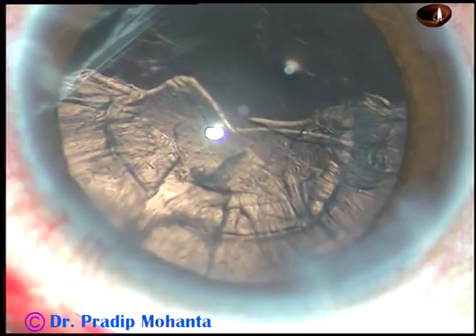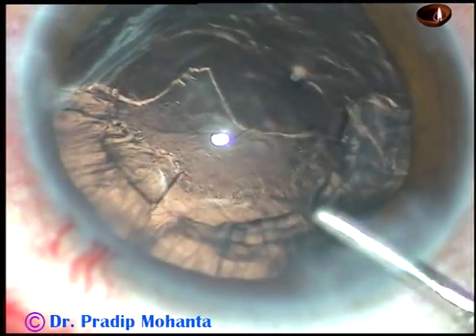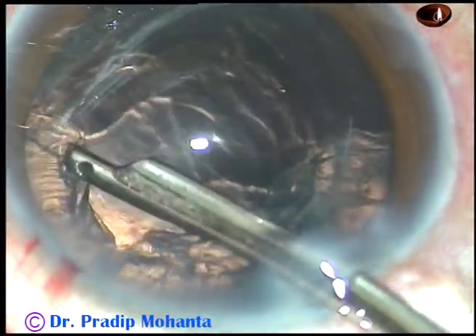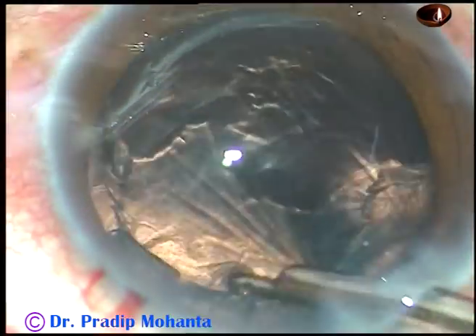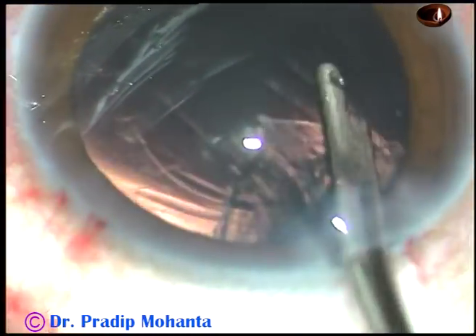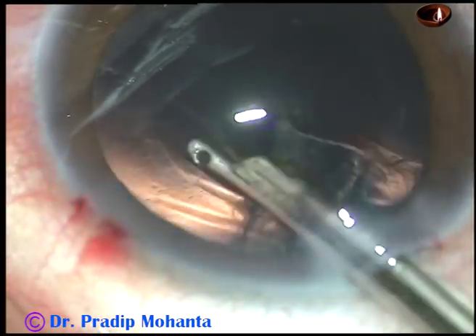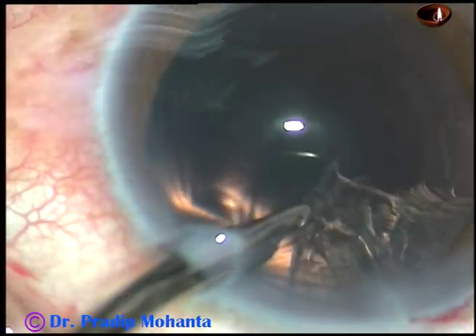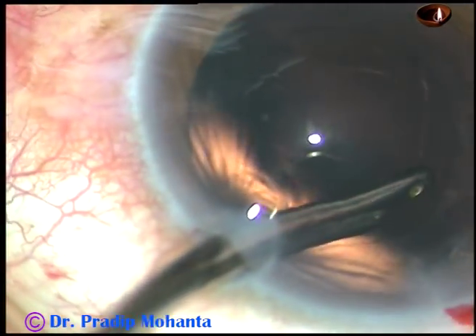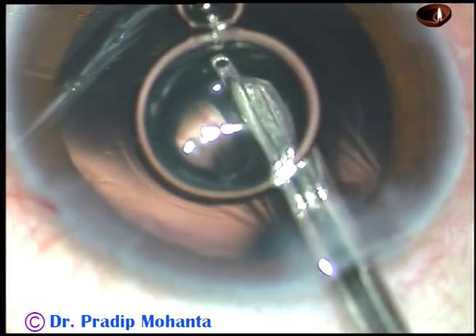The nucleus is managed and now cortical cleanup is to be done. The cortex is being removed with the help of a 23-gauge Simcoe cannula. You can use bimanual or coaxial irrigation-aspiration for removal of the cortical matter. The sub-incisional cortex is removed going through the side ports. There are some cells sticking to the posterior capsule that are gently removed by the Simcoe itself.